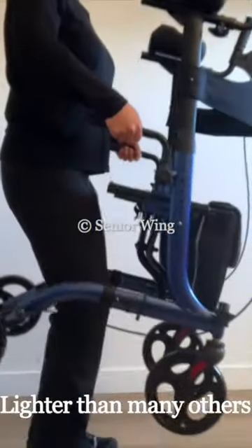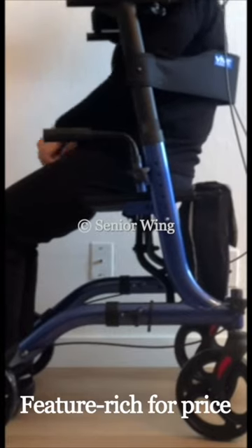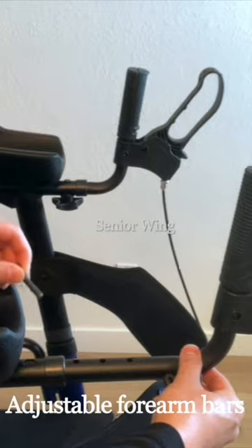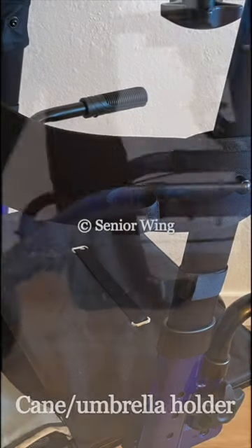Weighing just 20 pounds, it's lighter and more portable than many other upright walkers. It also includes a lot of extras for a mid-range device, like sit-to-stand handles, adjustable forearm lengths, foot lift pedals, wheel safety reflectors, and a cane or umbrella holder.